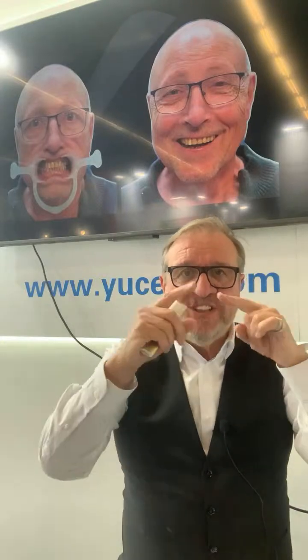So let's finish the presentation with one case. This is the case of one guy, and I make a dynamic picture, 1, 2, 3, 4, 5, to see how big is the smile and if the lips are symmetric or not. Are the lips symmetrized or not? Two pictures, one with retraction to see the gingiva, and another with a normal smile. So this is a picture of the case, the initial case.